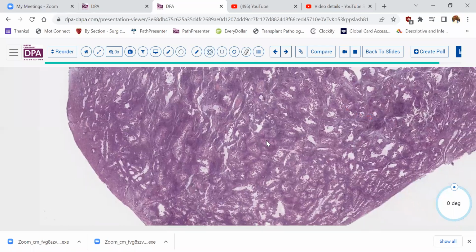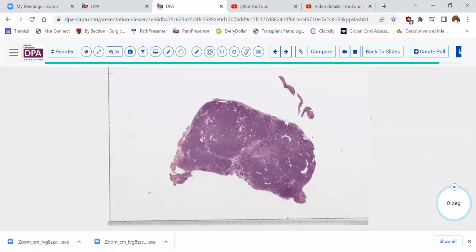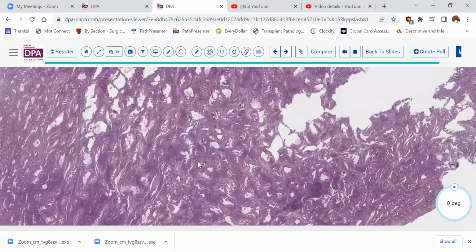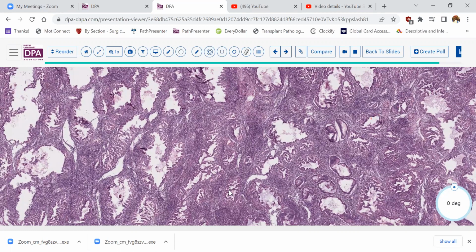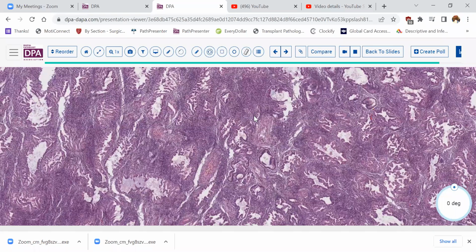So the other feature which I found useful in this case to reassure me that this was a more physiologic secretory hyperplasia without atypia was to do an immunohistochemical stain. I did a Ki-67 stain in this case and found that very useful because in this circumstance, there were numerous stromal positive nuclei, but there were no cells within the epithelium that were positive. And that would indicate to me that this was a secretory hyperplasia rather than a hyperplasia of a preneoplastic type.